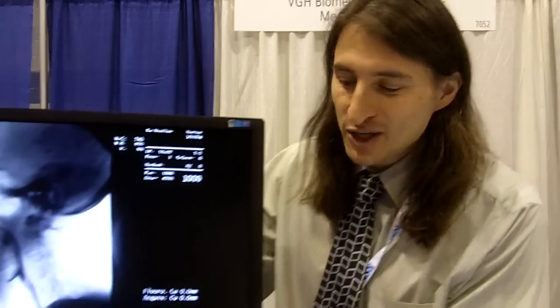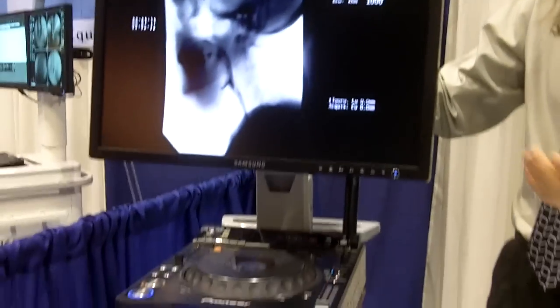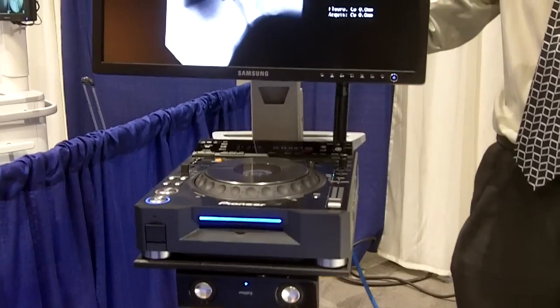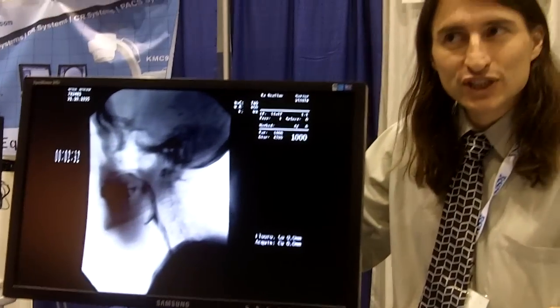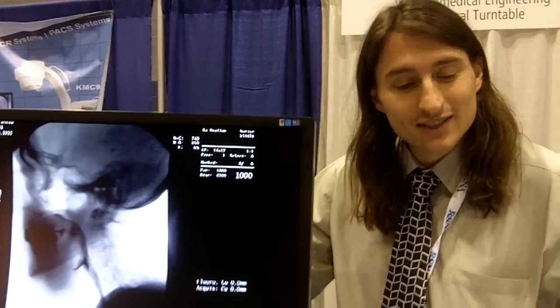We have a free-standing unit. It's mobile. We record this video onto a DVD. The cases are stored on DVD and archived. And then anytime a physician or a nurse wants to review the case, they grab the DVD.